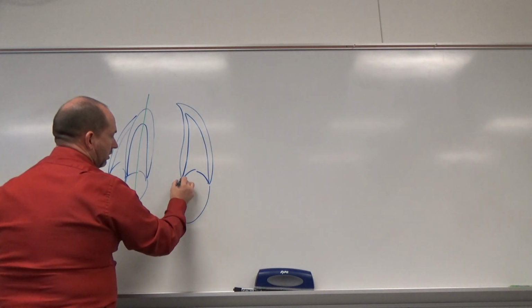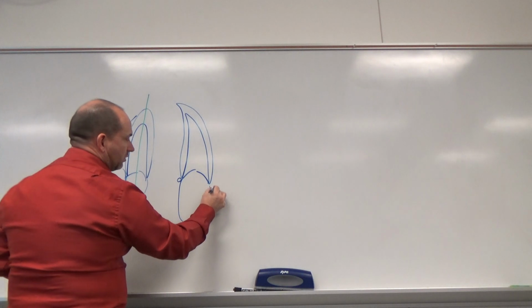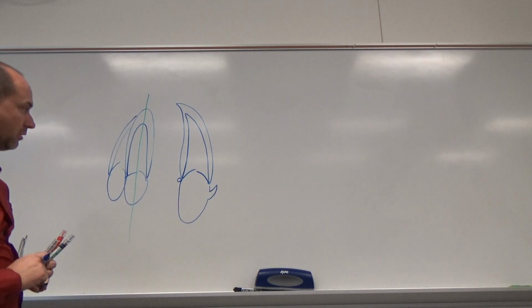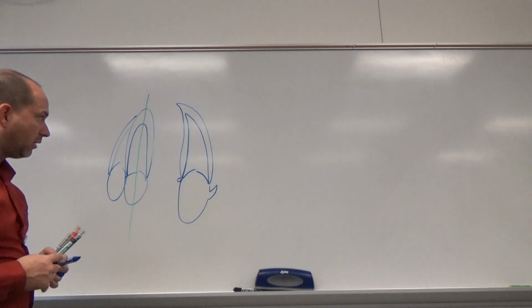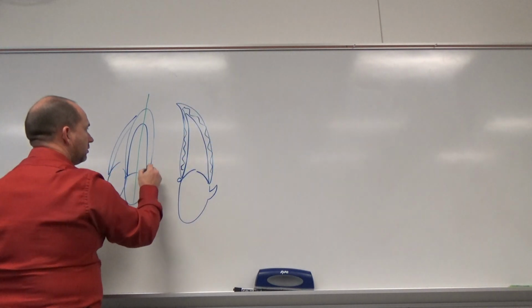Okay, we've got our coronary sinus is an inferior structure. We've got, if you can see it, and you can often see it, the left atrial appendage on the anterior aspect of that. For this image here, we're going to take a 2D clip of it. Just color the walls here real quick.